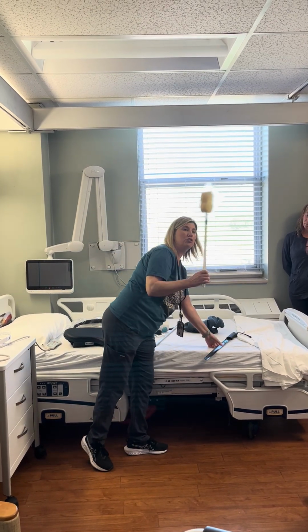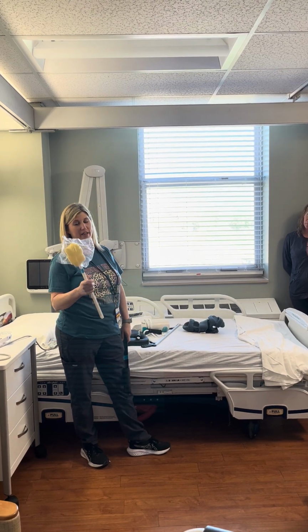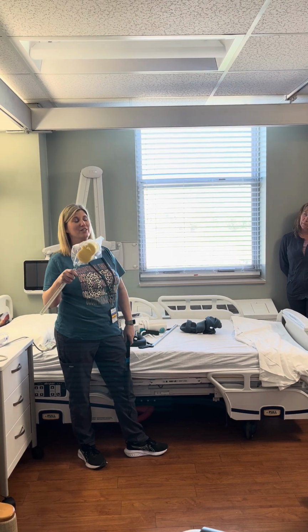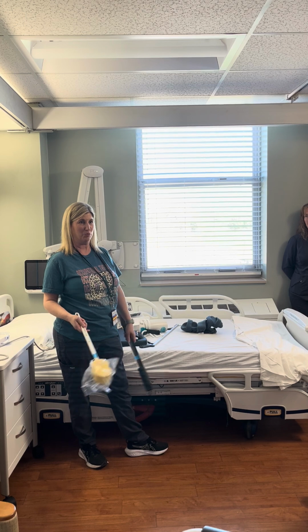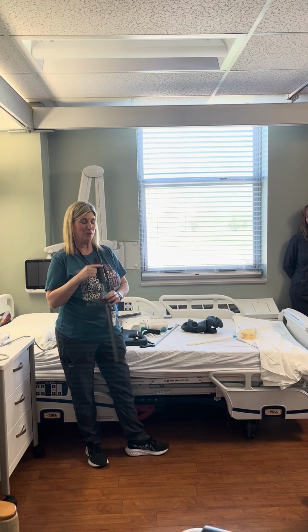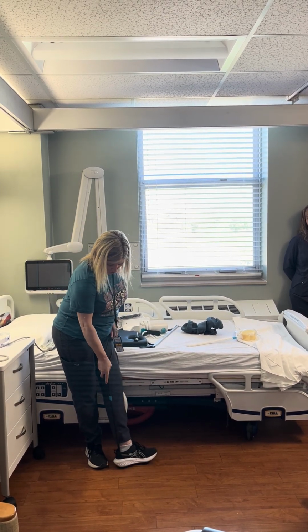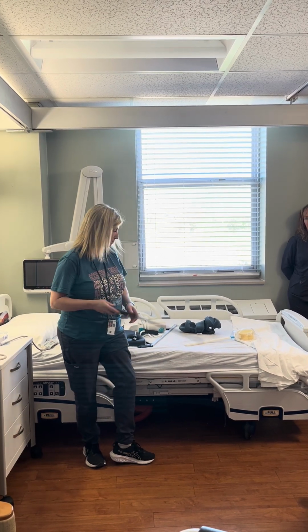Long sponge. Some of the guys we give these to do need it, but they like to save it for home. They don't want to unwrap it and use it here. So that's fine. They can use it and we can help them wash their back temporarily, just so that they have that ability to use it. And the long shoehorn. This can also be used to push their shoes off. They could just push that off, or stick it in there and the heel is going to slide right in.